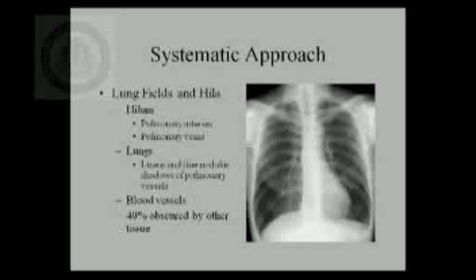Now then we will come on to the lung field proper as well as the hilum. The lung field proper should be interpreted starting from the hilar region, and the hilum is formed by the pulmonary arteries and veins, superimposed over the lymphatics and the small lymph nodes which are normally not seen in a chest X-ray.